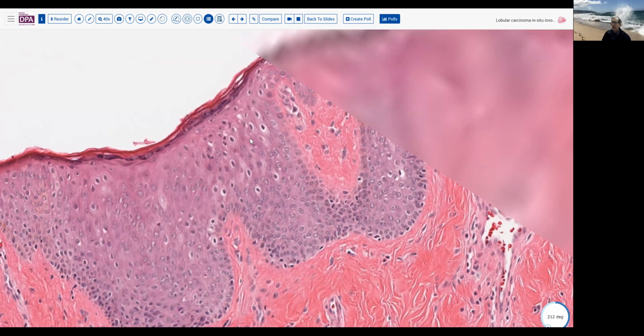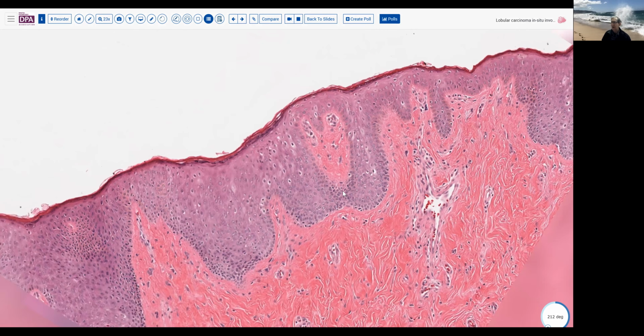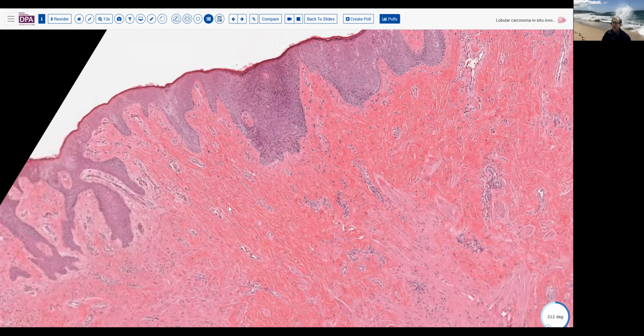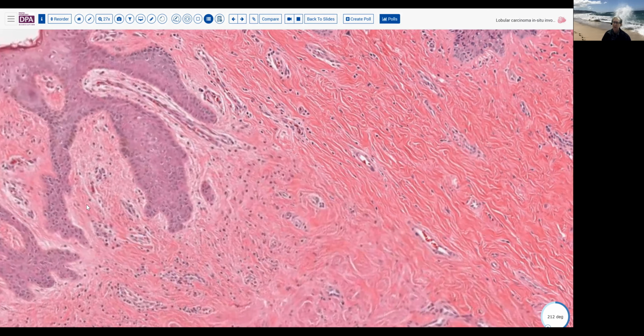Now, you can do, of course, special stains. You would not want to use E-cadherin, of course, but cytokeratin 7 and P120, HER2 sometimes are all excellent stains to help demonstrate the possible presence of lobular carcinoma in situ that has extended to become Paget's disease of the nipple. Just some thought processes to be aware of when you see that sort of involvement of subareolar ducts.